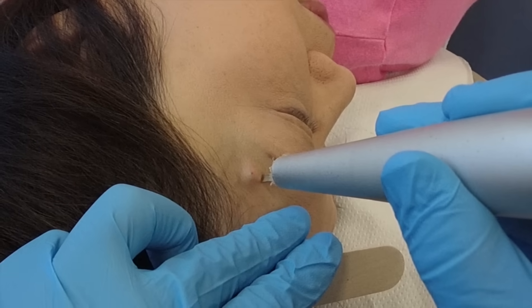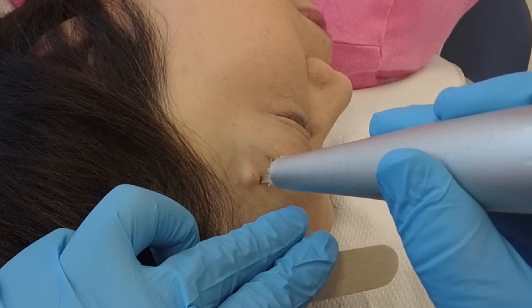If you want to skip the explanation, I'll show you what I use — basically a laser. This is my method of actually extracting a dilated pore of Winer. I'm using a CO2 laser, 1mm spot size, drill mode.